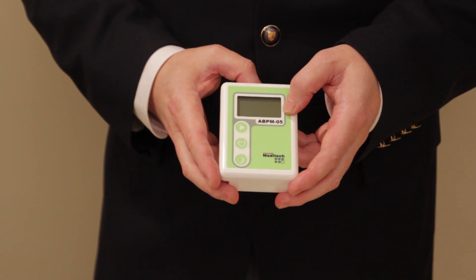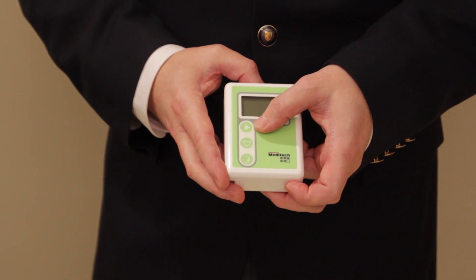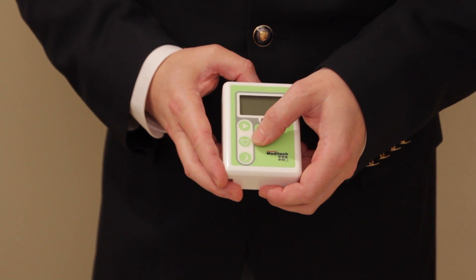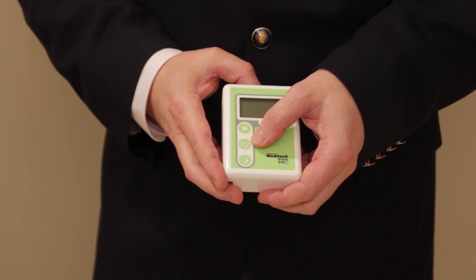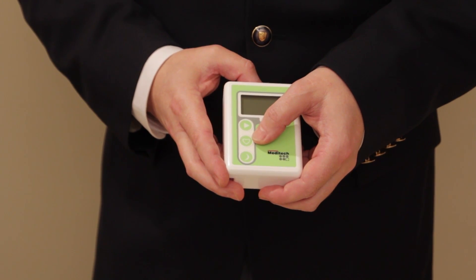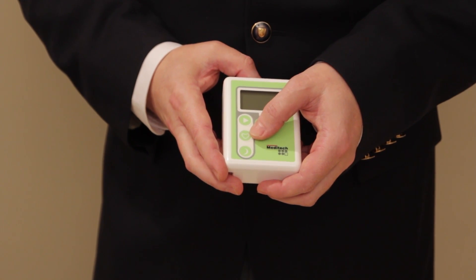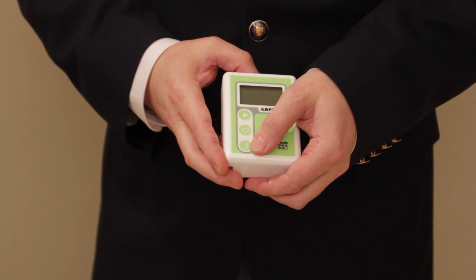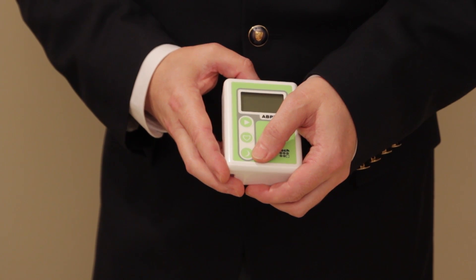The device has three buttons. This button lets you start an extra manual measurement in addition to programmed measurements. The middle button marked with a heart is to mark events. Whenever a patient takes a medication, has some strange feeling, or wakes up, they can simply push this button to set an event marker, which the device will store in its memory. The last button lets the patient switch from day to night mode if the device is so programmed.